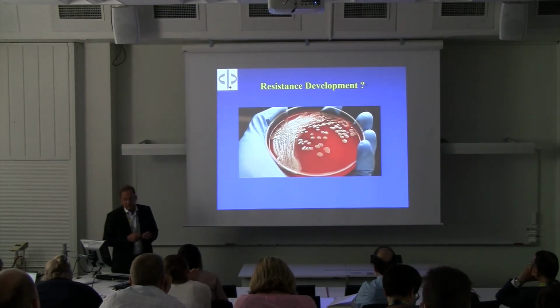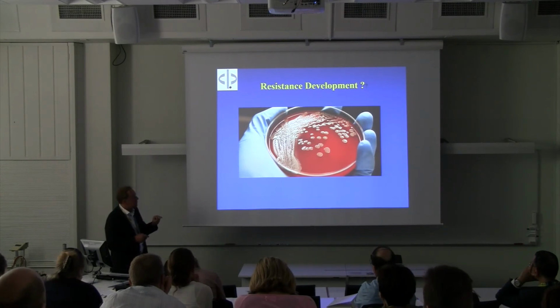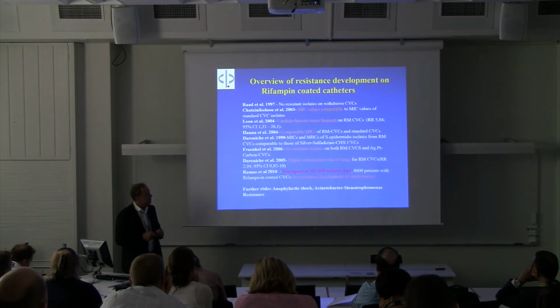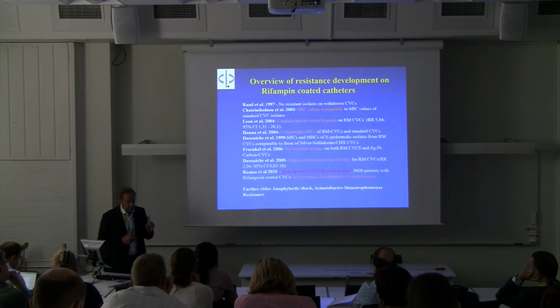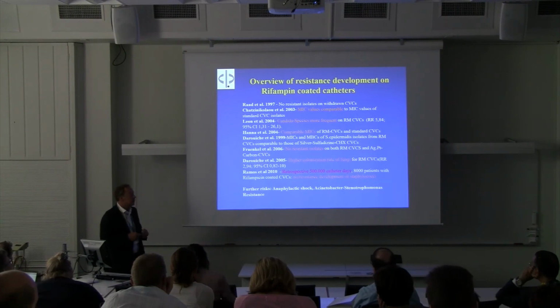What about resistance development? If you place any topical antimicrobial treatment, it's the first question coming from internal medicine or microbiology: you are using rifampin, you are using chlorhexidine, what is going on over time? There has been a lot of work investigating nearly 1 million catheter days with chlorhexidine as well as rifampin-coated catheters, and nobody could find a hint to date for resistance development.